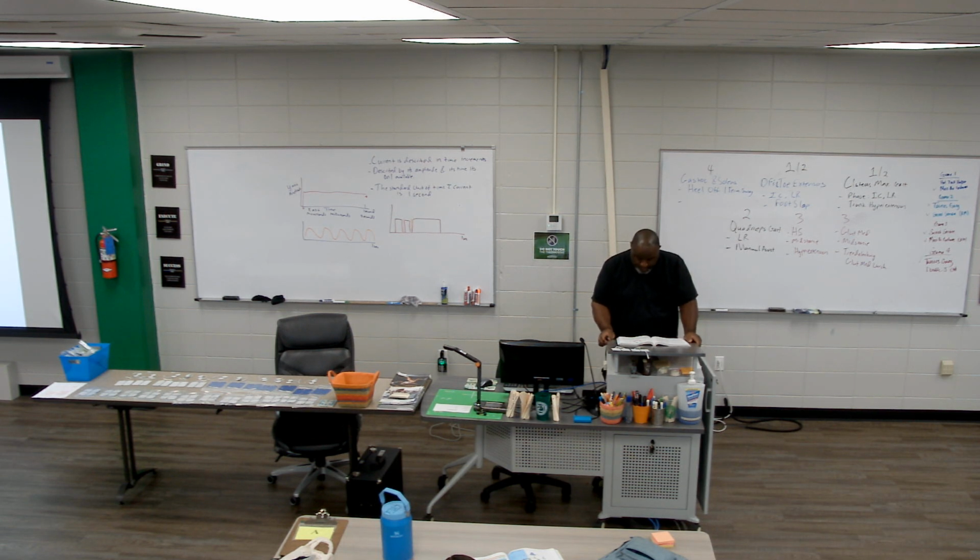And then polyphasics have multiple phases occurring above and below the isoelectric line. So this one has 3, but it can have 3 or 4 or 6. It can be multiple. It's up to the manufacturer how they're programming it relating to polyphasic.